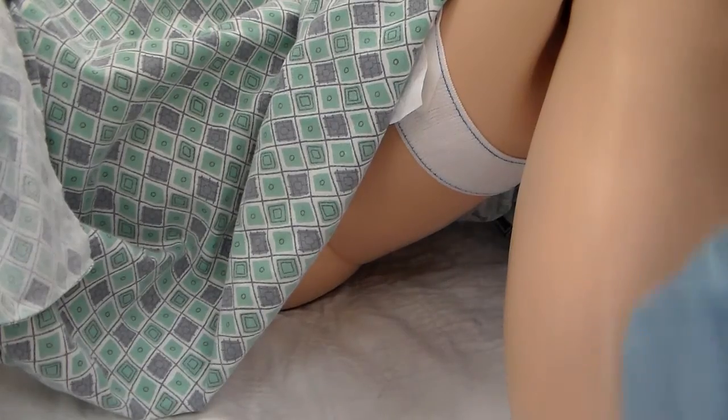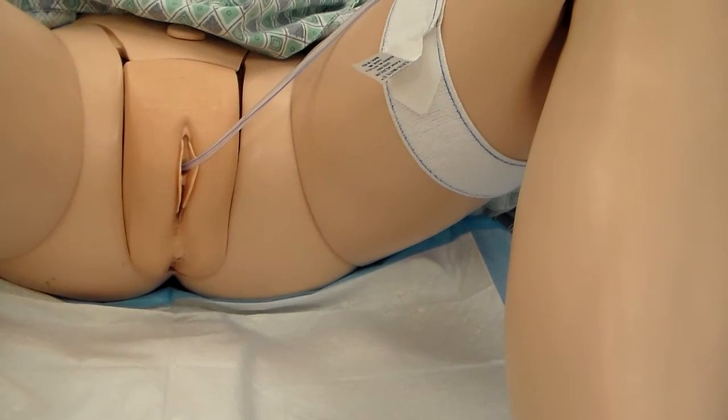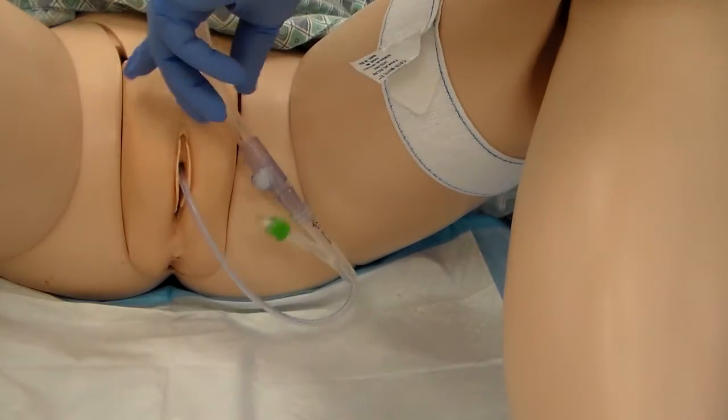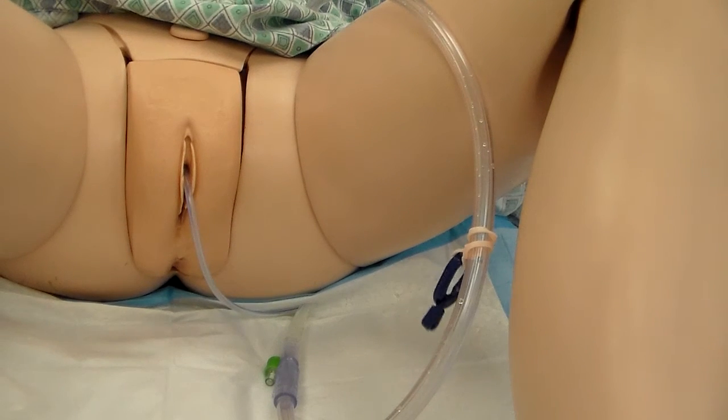All right, so we're gonna gather our supplies and we're gonna perform WIPSA, okay? Then we're gonna position our clients supine and spread their legs like this for ease of removal, okay? We're going to put our chucks down underneath the peri area, okay? And then we're going to remove the leg band that attaches the Foley catheter to our patient, okay? We're going to make sure we don't pull on that catheter, okay? All right, so then we remove the leg band. They don't need that anymore. We're taking it out, right?